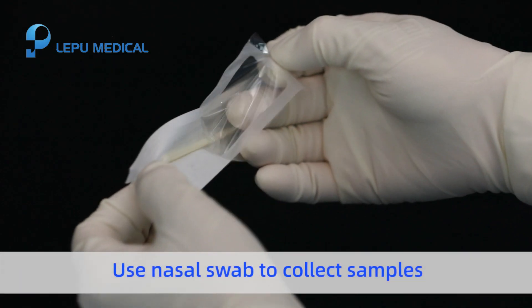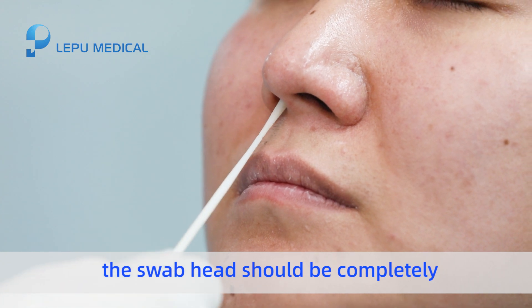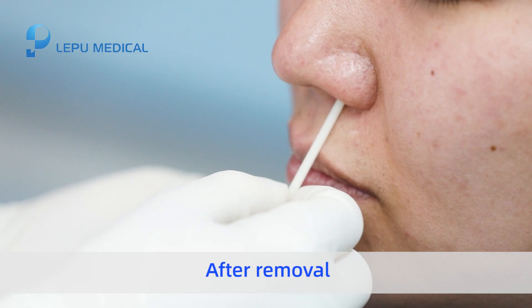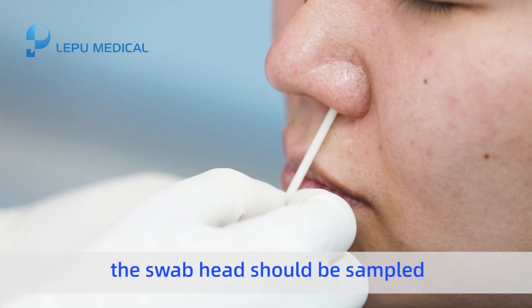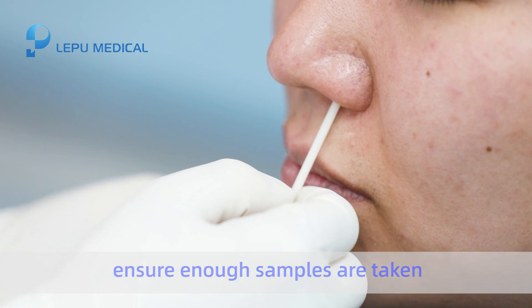Use a nasal swab to collect samples. During sampling, the swab head should be completely inserted into the nasal cavity and gently rotated five times. After removal, sample the other nasal cavity the same way to ensure enough samples are taken.